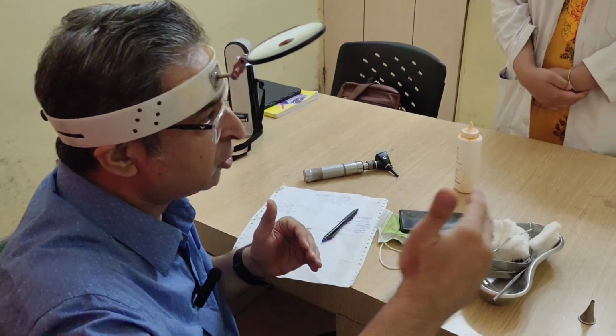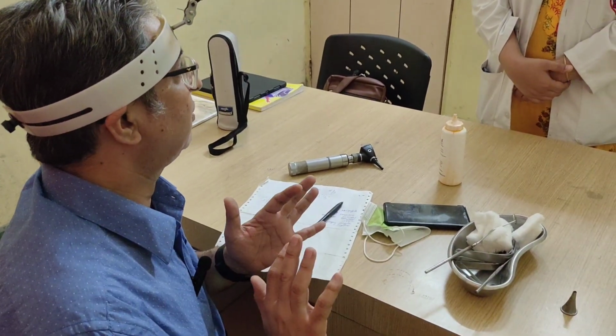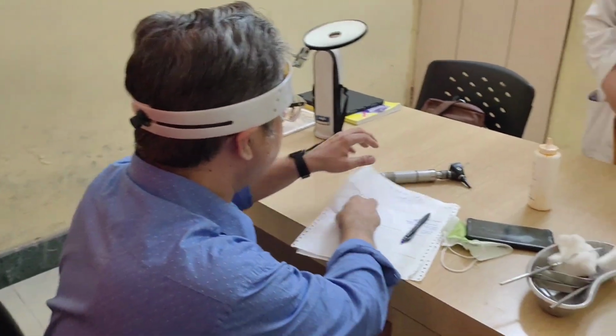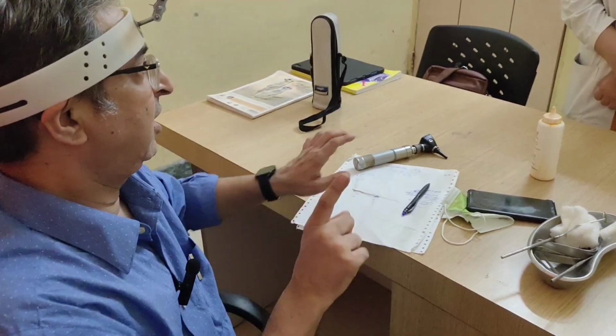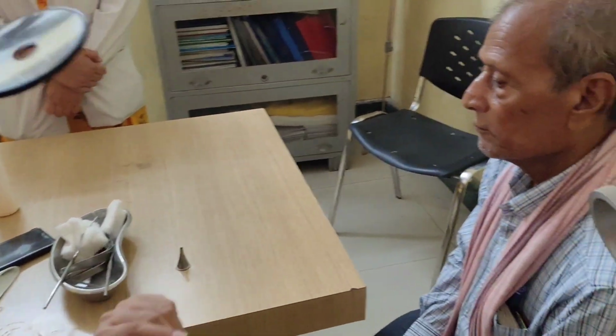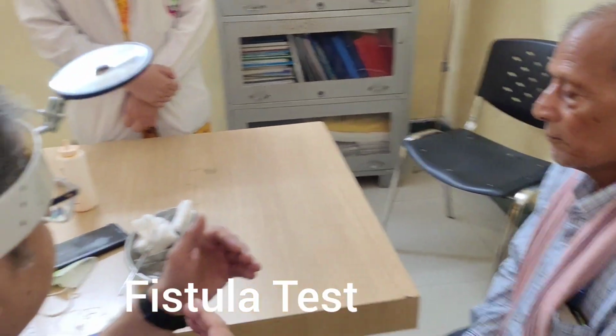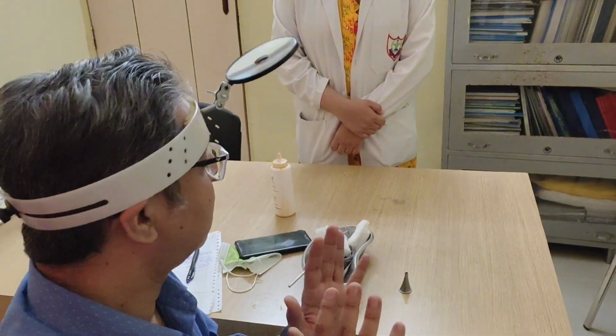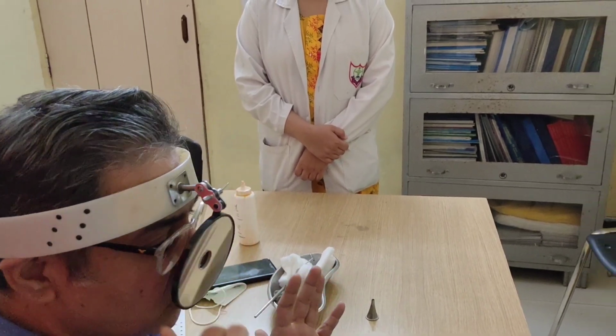Then you proceed to the functional examination. In functional examination of the ear, the common test that you are supposed to do is a fistula test. That is when you are suspecting an erosion of the semicircular canal, and there is a communication with the inner ear. How do you do a fistula test?